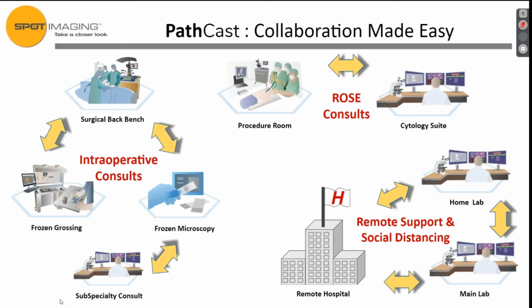Rapid on-site evaluations are also performed between procedure rooms and the cytology suite, allowing the cytologists to stay at their desk doing their work rather than being tied up waiting for the procedure room results. We also support remote and social distancing to remote hospitals back and forth to the main lab, as well as doctors or personnel who may be off-site at their home office.